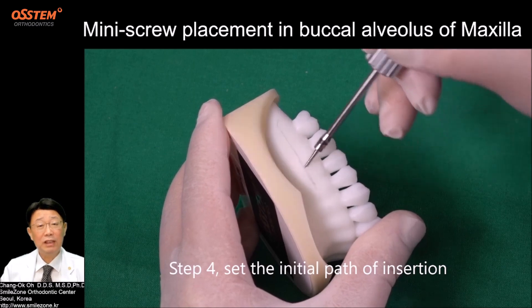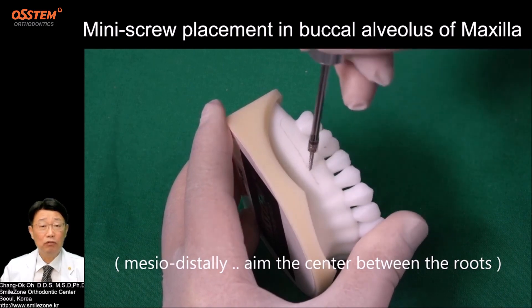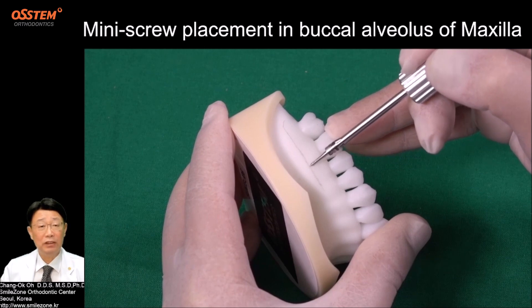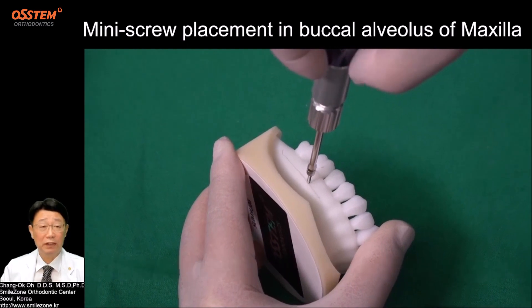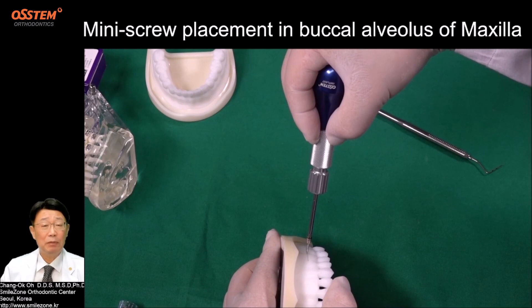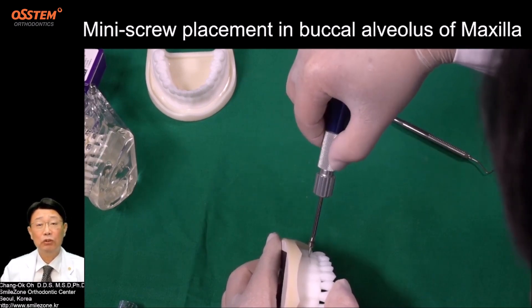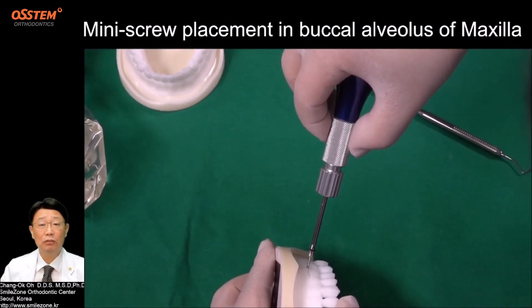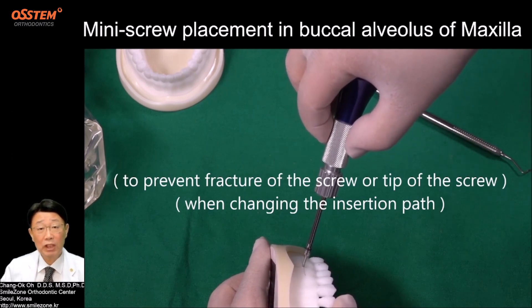Step 4: Set the initial path of insertion. Medio-distally, aim the center between the roots — not heading distally or medially. Occlusally-gingivally, perpendicular to the bone surface, to prevent slipping of the screw at initial penetration. Step 5: Start turning the shaft to insert the screw one to two millimeters. Step 6: Stop insertion and reverse-turn to pull back half, to prevent fracture of the screw or tip when changing the insertion path.